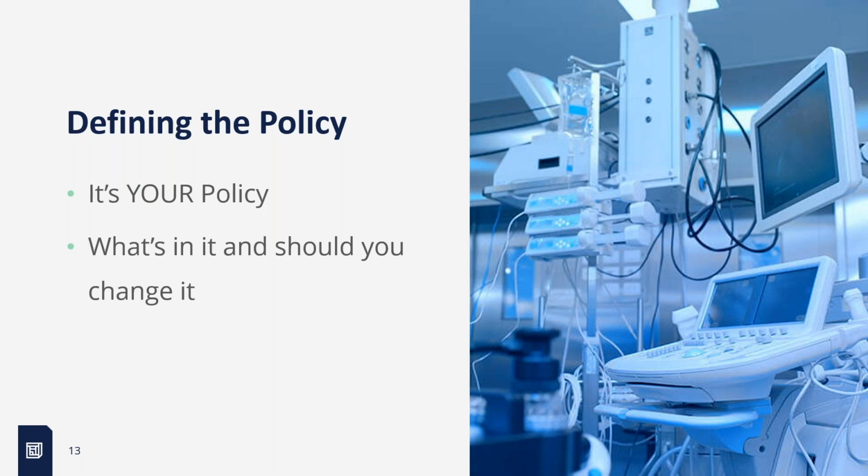It's kind of like how HTM is now the new clinical engineering; ITM is the new PM. Because you're not really preventing, you're inspecting to make sure, and testing to make sure it's safe. So it's a combination of inspecting, testing, and maintenance. But everyone still calls it, we're doing PMs this week, or scheduled maintenance, yeah, scheduled maintenance.